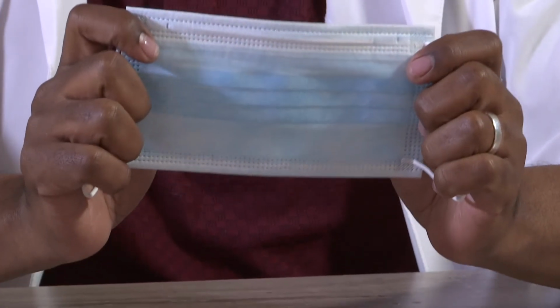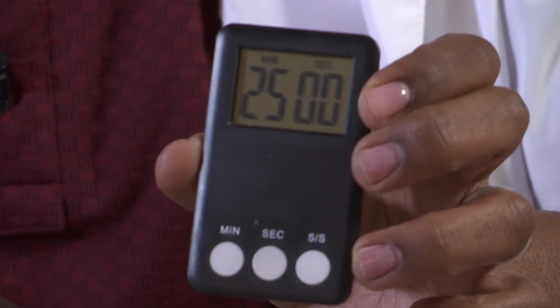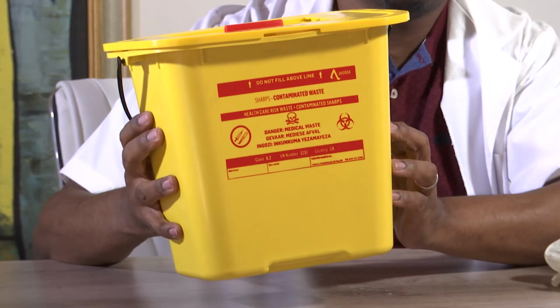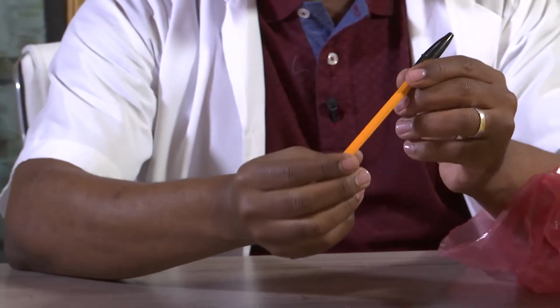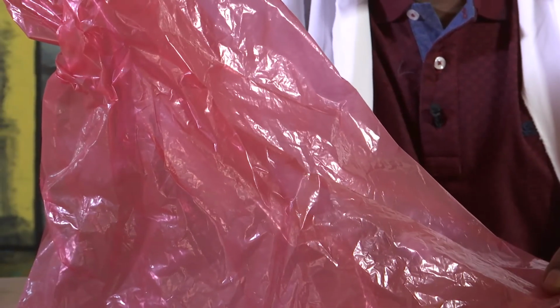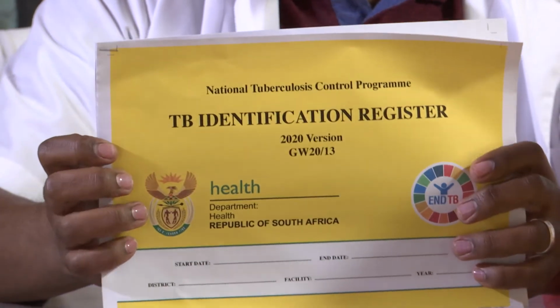At all times in the clinical settings, due to COVID-19, we should be wearing our masks. 1, you need a timer. 2, you need gloves. 3, you need blotting paper. 4, you need a sharps container. 5, you need a pen and a sharp permanent marker. 6, you need a biohazard disposable bag. 7, you need a TB identification register. You also require a patient clinical record or ART stationery.